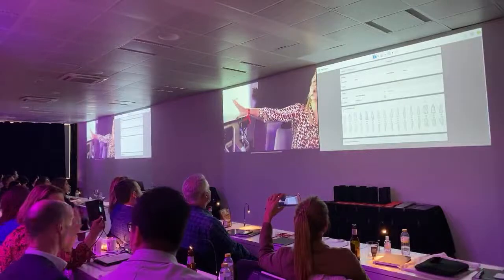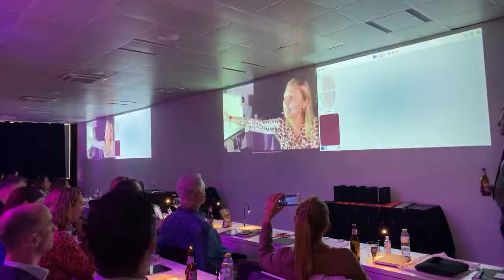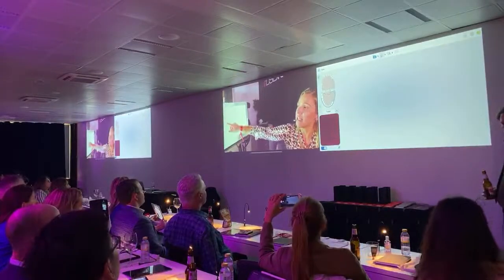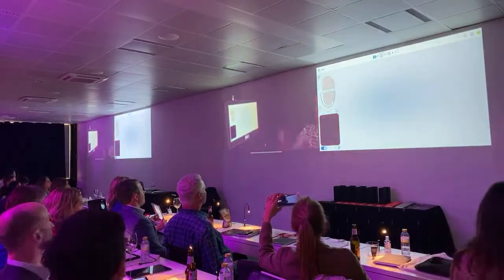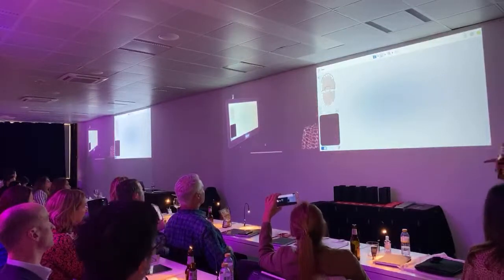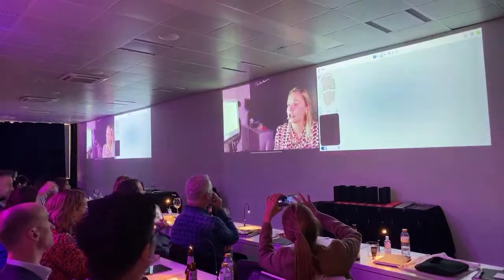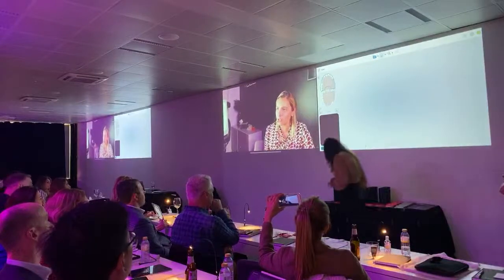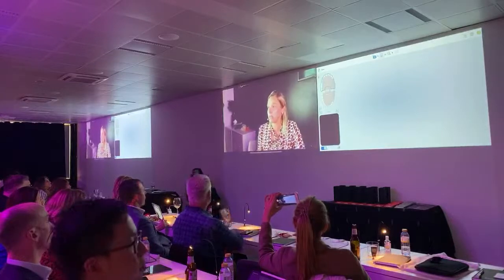After you doing all your preps, now you're gonna go to the scanning part. So now you see here that iTero tells you what to scan in those white teeth, okay? Of course that you can scan the whole arch, but it's not necessary. So let's begin in the upper arch. And the first thing that we're gonna do is to scan the arch. You don't need to pay attention in details of the prepped part. Just the adjacent part, the contact points, these you have to be attentive, okay, to copy.